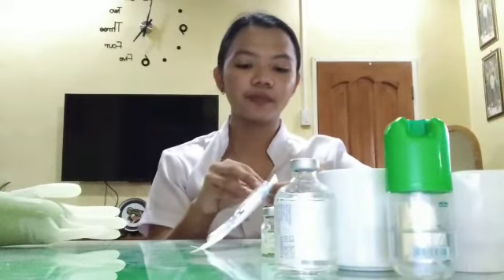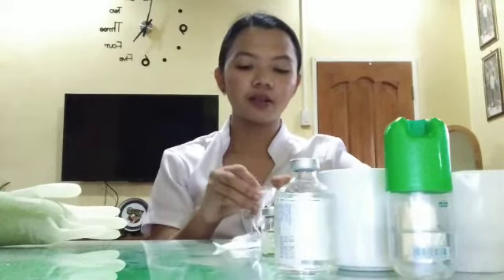And then after that we will withdraw the prescribed amount that is indicated in our medication ticket according to our doctor.